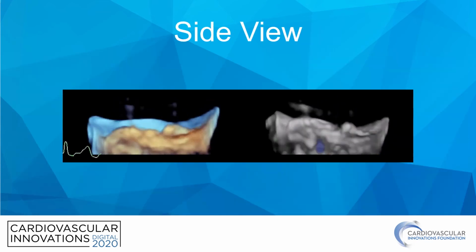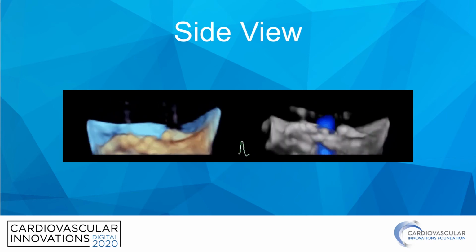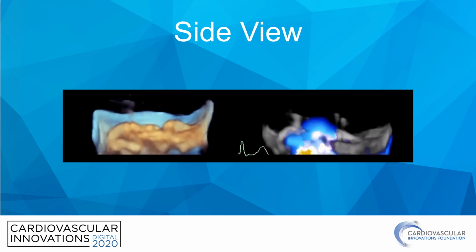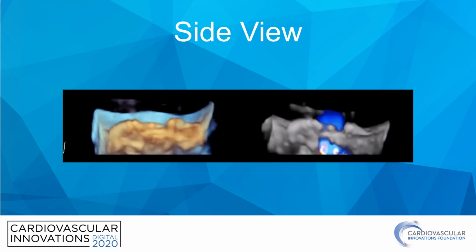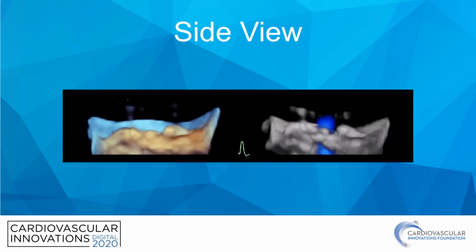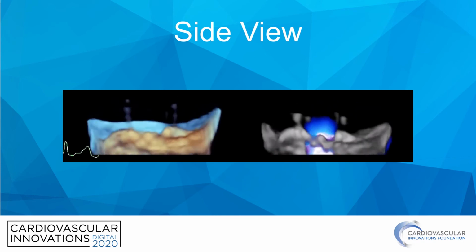By manipulating the image, we can see a side view with the LA arms on the top and the coronary sinus arms below, and the tissue of the LA wall and coronary sinus in between. The LA to coronary sinus shunt is also demonstrated with the addition of color flow imaging.